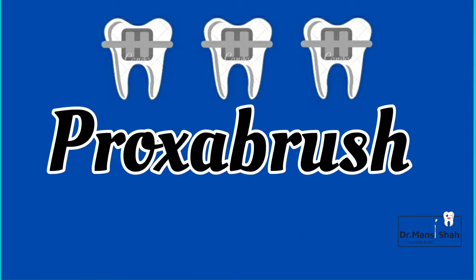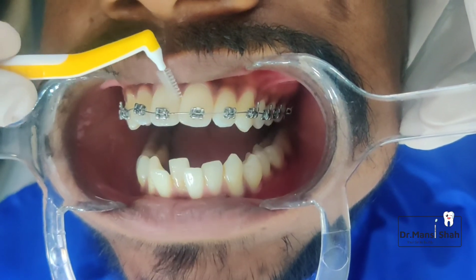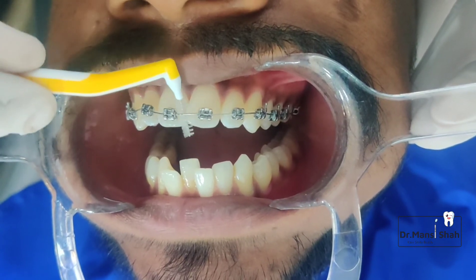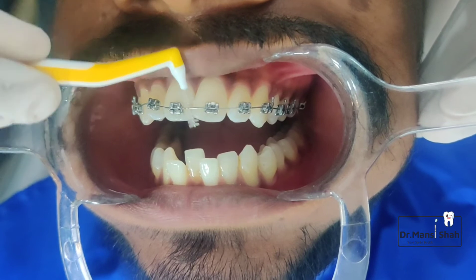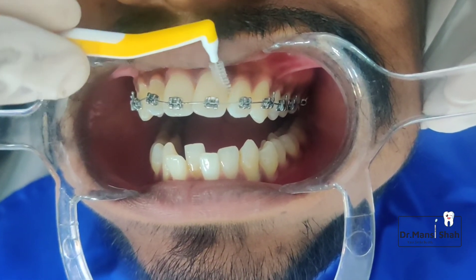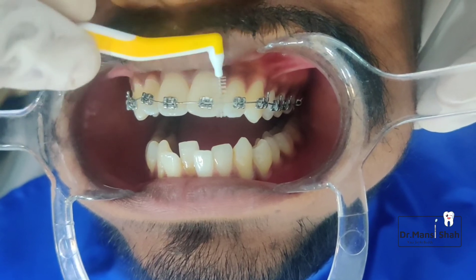The next is the use of a proxa or interdental brush. This is a small bristled brush. You can use it in between the arch wires, your brackets, and the teeth. It is also used to stimulate the gums. Just move the brush gently under the arch wire to remove all the food lodgment.